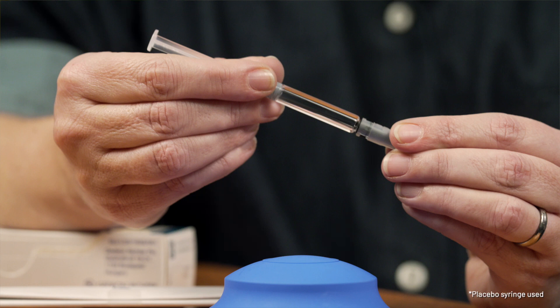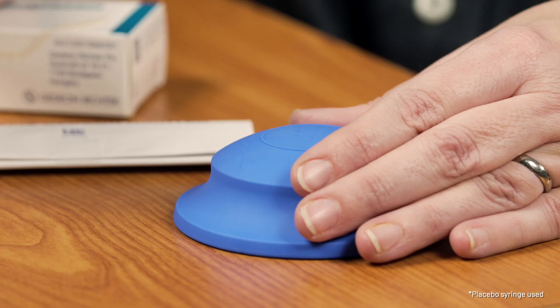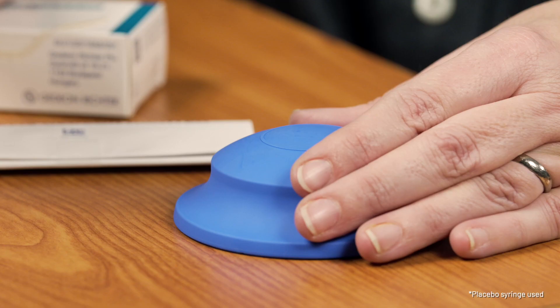So let's talk about the injection technique. When you are ready to inject, pull off the needle shield or cap from the syringe holding it horizontally and pointing it away from you. Do not twist — just pull the cap off the needle syringe.